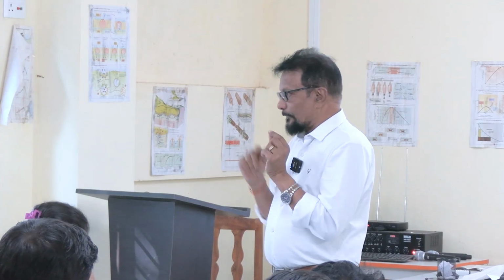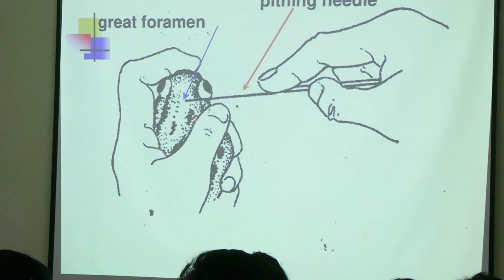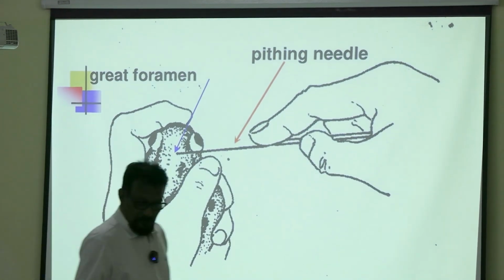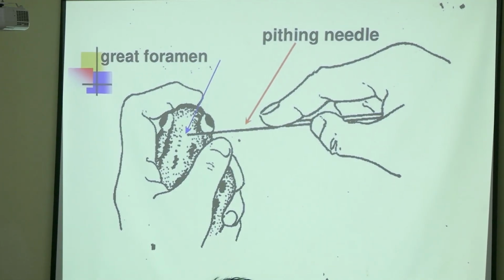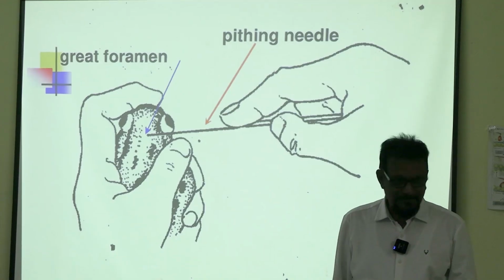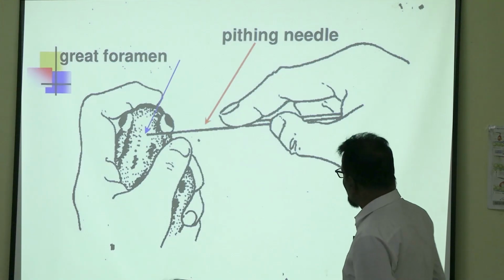And this nerve and muscle is isolated from the frog. And how is it isolated? So this is the frog. You need a needle and a frog. So first, you have to stun the head of the frog on a hard surface. Then you can use a rod to stun the head so that it becomes unconscious. Okay. Then what you have to do?